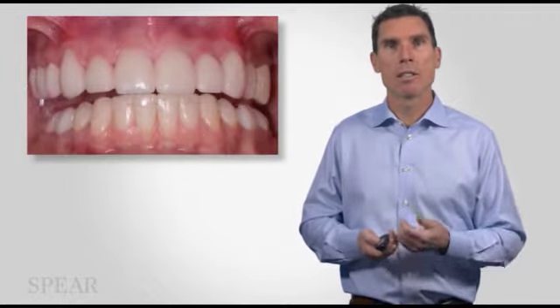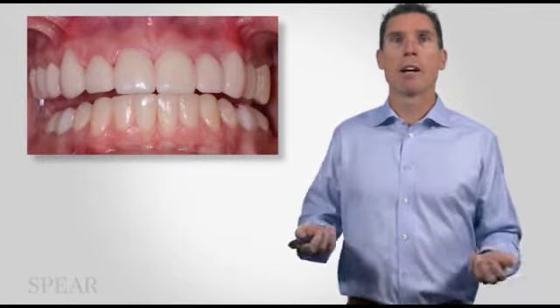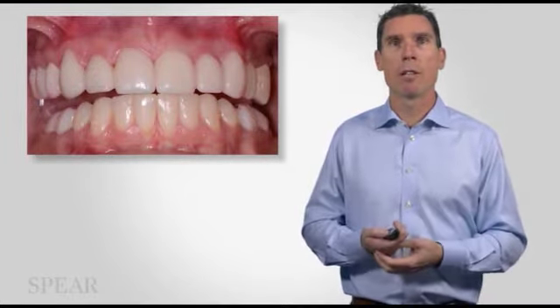And in protrusive, it's exactly as the models were. There are no surprises at all. So now I could come in after a little bit of time making sure she feels good, and I could go ahead and mill all those lower teeth. I can put permanent restorations in on one day.